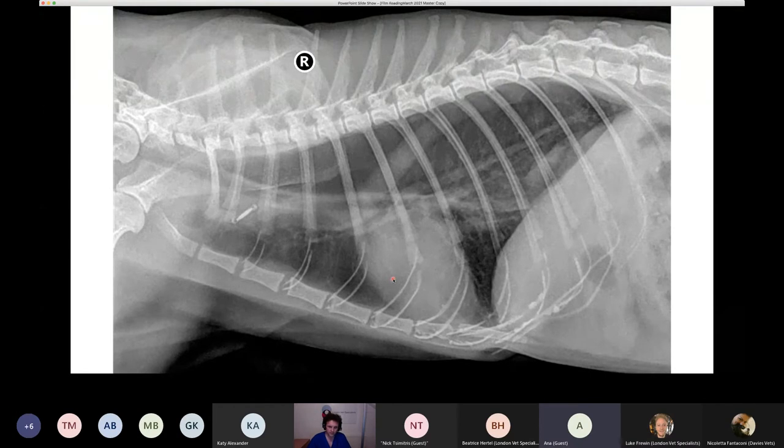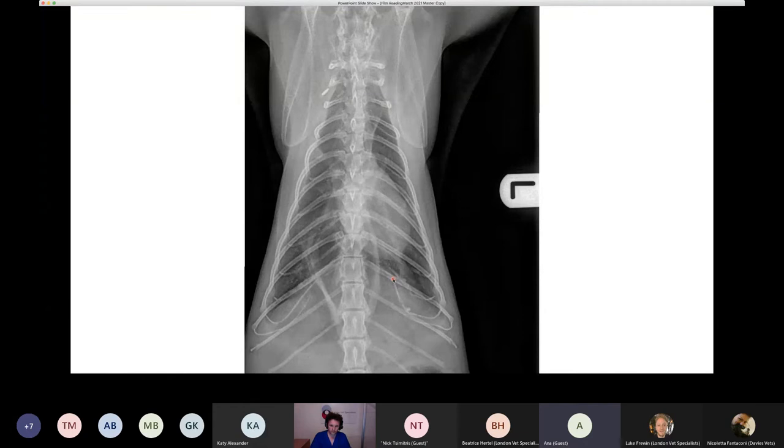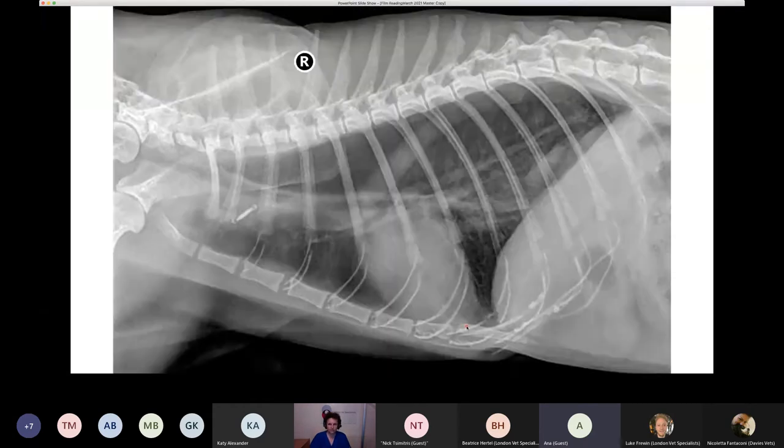Okay, so there are two lateral radiographs, a left and a right, and a VD as well, I believe. The skin and subcutaneous structure looks normal to me, as do the skeletal structures, so the ribs, sternum and scapula. On the right lateral, looking at the lung fields, I thought that they were kind of overinflated, that maybe the diaphragm was a little bit flatter, and that the caudal lung field was extending pretty caudally. I'm not sure if you agree or not. Yeah, no, absolutely. Totally agree. Then the cardiac silhouette looks pretty small. It's only taking up sort of half of the vertical space and only two rib spaces.